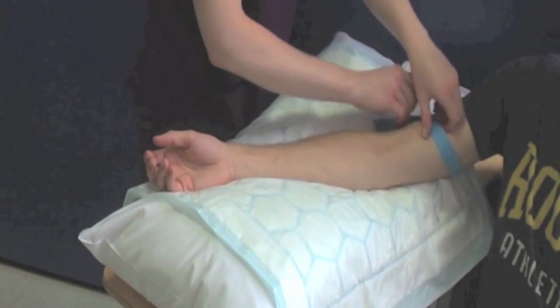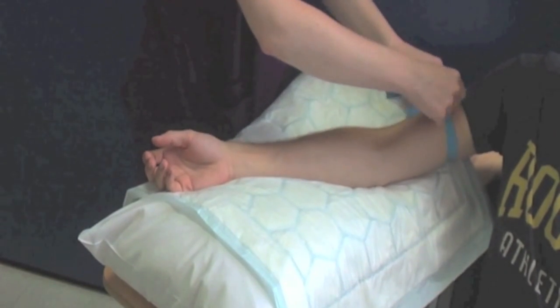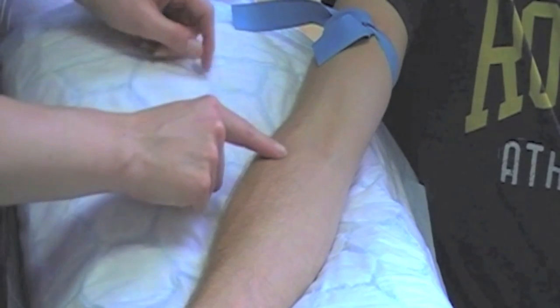Apply a disposable tourniquet to the patient's arm and palpate for a suitable vein. Once you have located the vein, release the tourniquet until just before you perform the procedure.